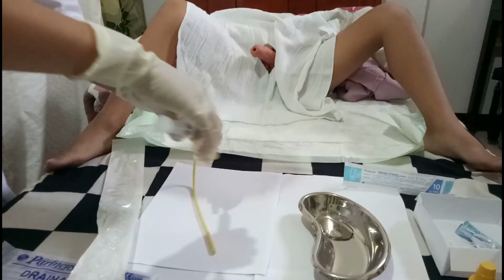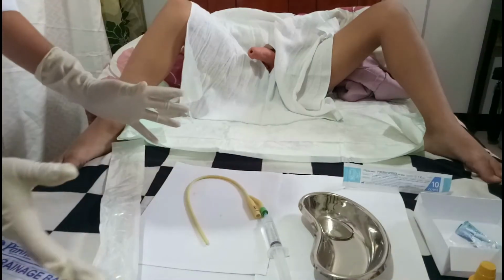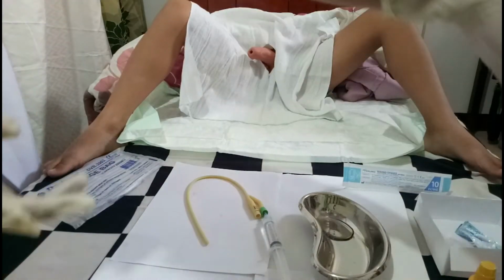So in other institutions or hospitals, some of the nurses prefer to test the balloon of the Foley catheter, but for now I'm not going to test it. I'm just going to leave the syringe attached to the catheter. And the urinary bag, which is this one, should be in here. And I'm going to discard this one.